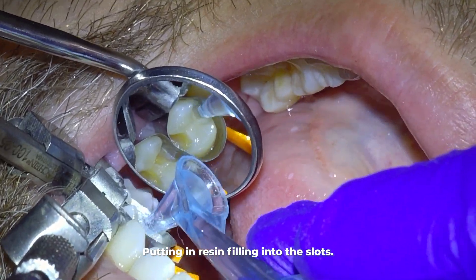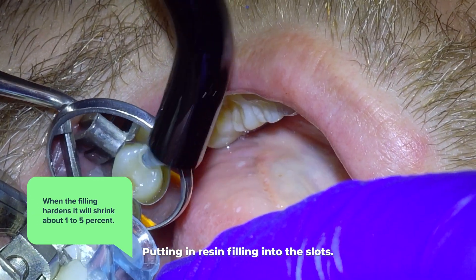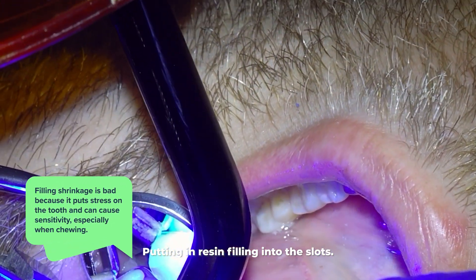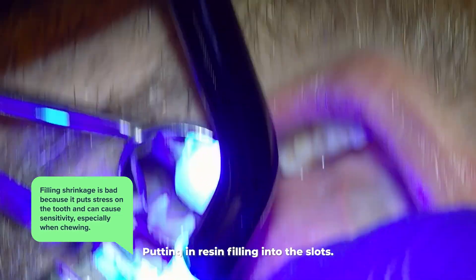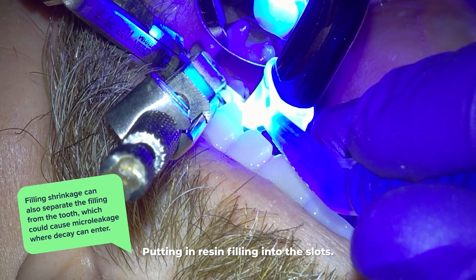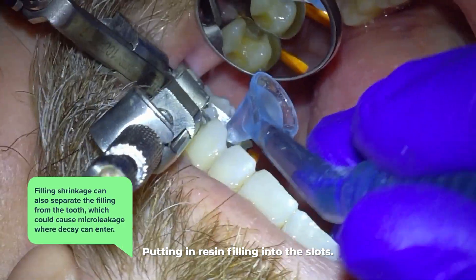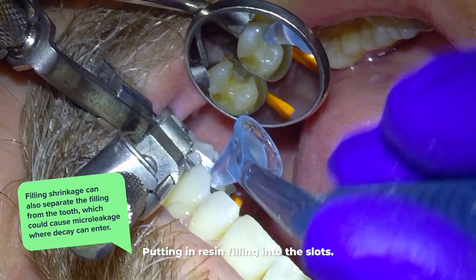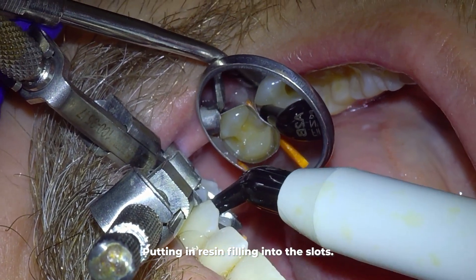An important note about resin fillings is that when they harden they will shrink about one to five percent. Filling shrinkage is bad for two reasons: it puts stress on the tooth and can cause sensitivity, especially when chewing. And that shrinkage can also separate the filling from the tooth, which could cause micro leakage where decay can enter between the tooth and the filling. So it's important to get as little shrinkage as possible.